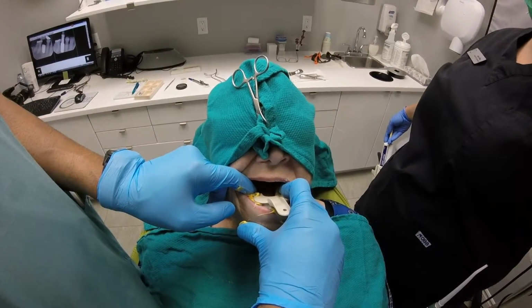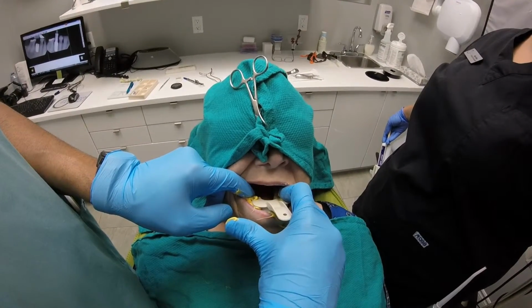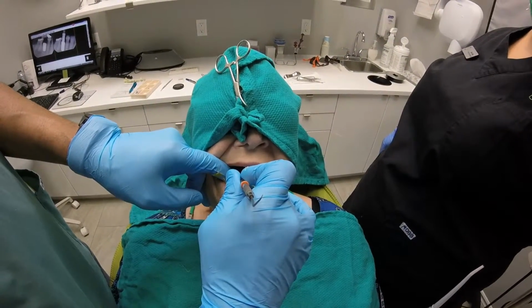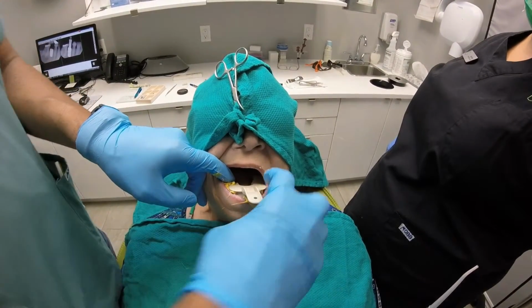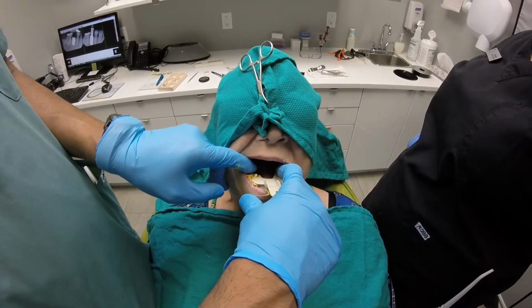So I like using light body. You don't have to use a ton of it. We use mostly heavy body because you want some firmness to the impression material around this transfer coping. But if you don't use it, you'll get a very, very poorly detailed impression. So we're just taking the bits of the impression material off that little port there so we can get the screwdriver back in there to pop this puppy out.